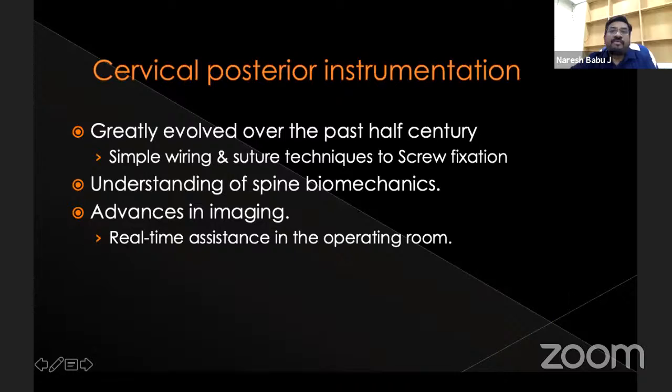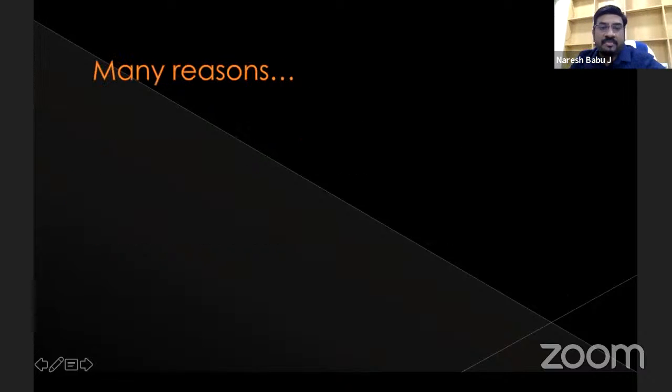Cervical posterior instrumentation has greatly evolved over the past half a century, from simple wiring to suture techniques to screw fixations. And the understanding of spine mechanics has evolved so well, and the advances in imaging have also made this real-time assistance possible during operation in the theater.